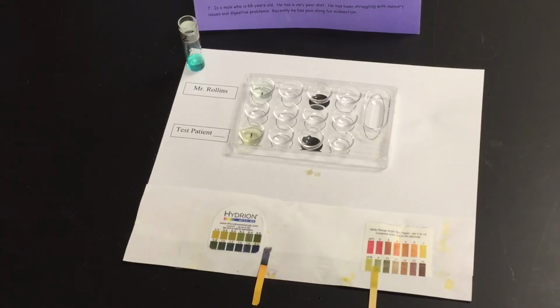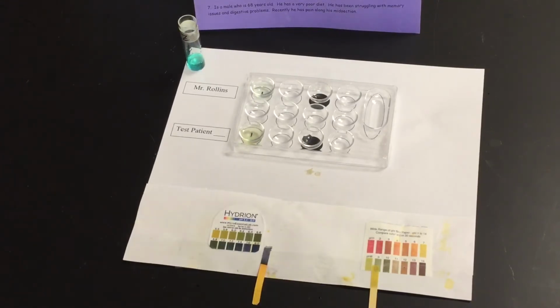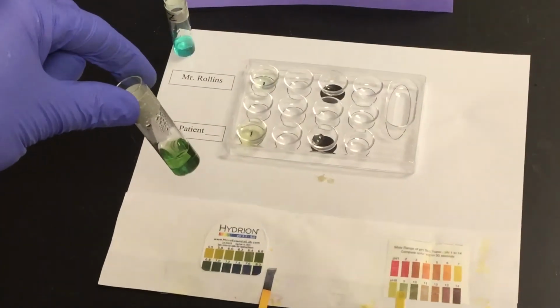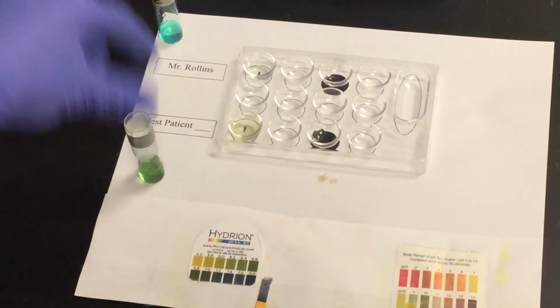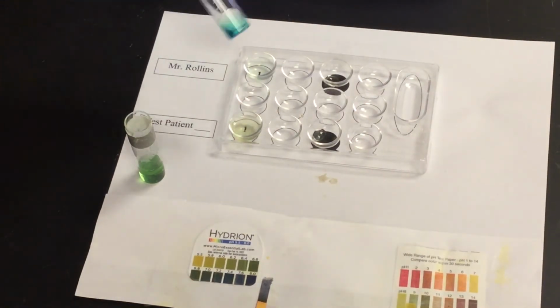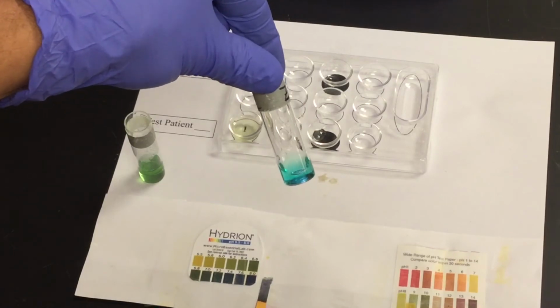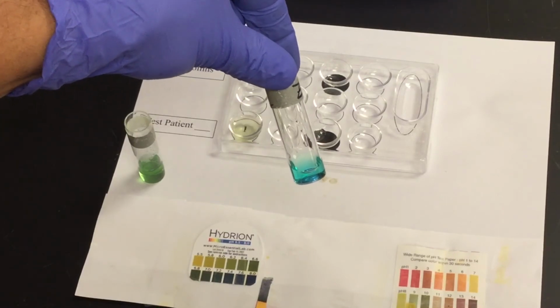So now we are looking at our sample that we have for glucose. Pulling that sample off of the water bath, we are going to take a quick look at it. And this is kind of what we have. So I have Rollins there, who is our normal patient, our control patient. Remember, that Benedict solution is kind of that turquoisey blue color. So anything that looks like that color is going to be negative.